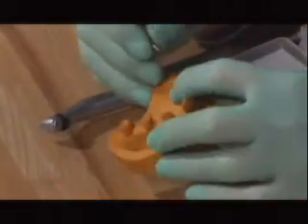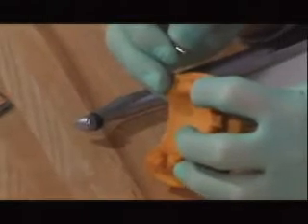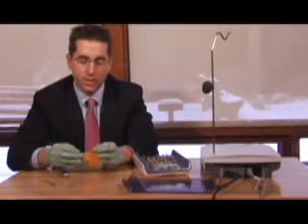I'd like to also show you with the healing abutment removed, this dental implant is about 2 millimeters away from tooth number 5, the distal number 5. That's an ideal position. It'd be ideal for restoring the case.